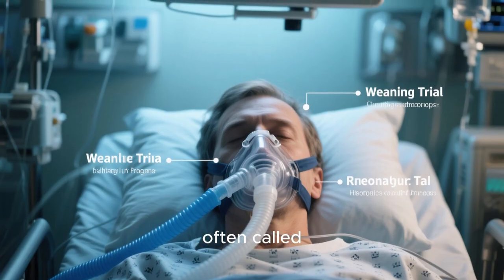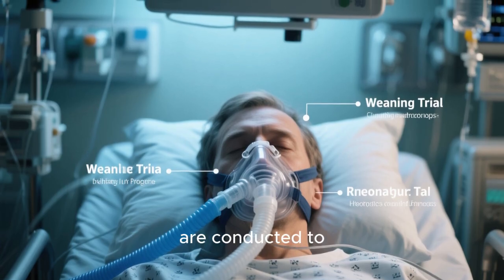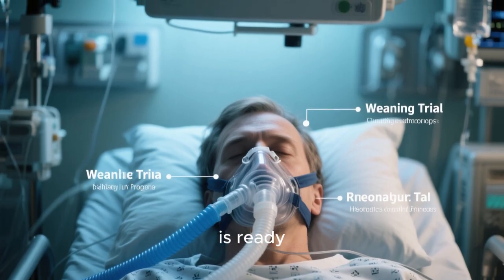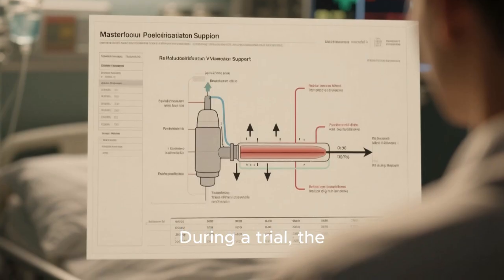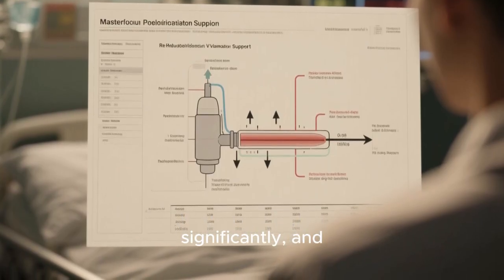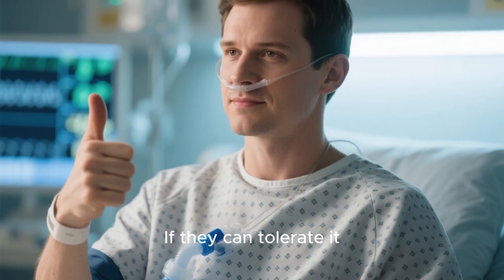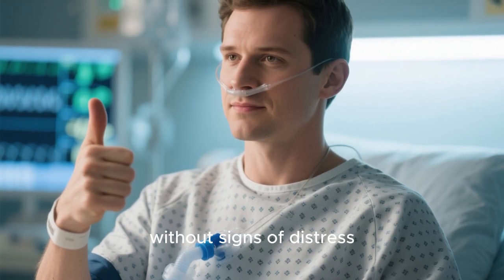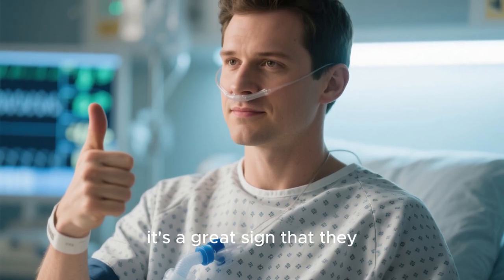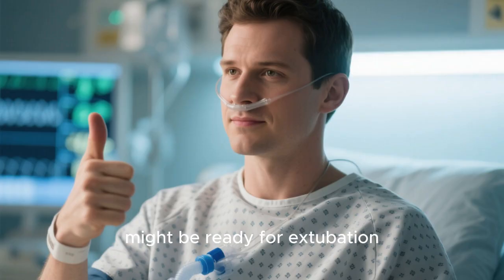Weaning trials, often called spontaneous breathing trials, are conducted to see if the patient is ready. During a trial, the ventilator support is reduced significantly, and the patient is closely monitored. If they can tolerate it without signs of distress, it's a great sign that they might be ready for extubation.